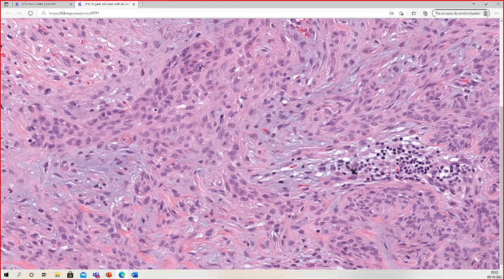On a small biopsy of an area like this, it would be very easy to say infiltrative carcinoma — basal cell versus squamous cell. I'm not sure. Sometimes I do that on a small shave biopsy. Are shave biopsies common in France? I hear both no and yes.